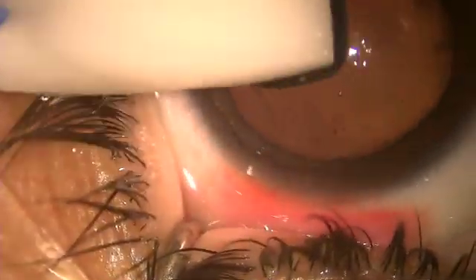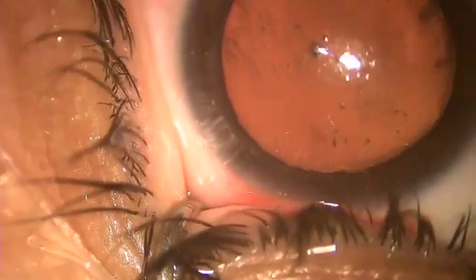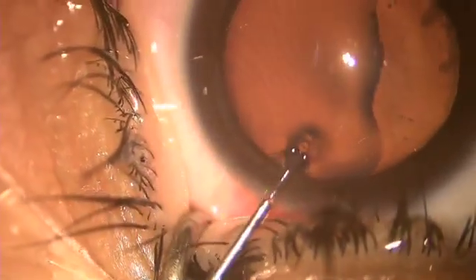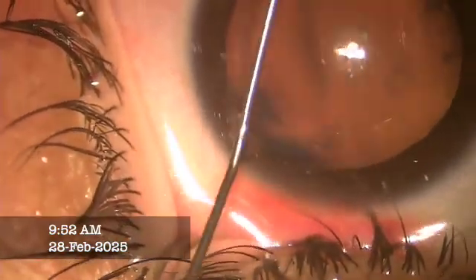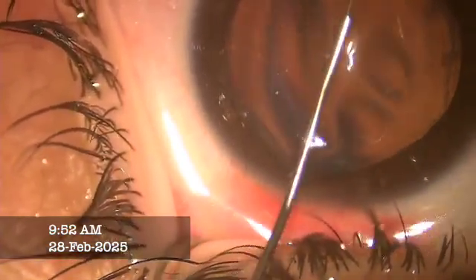Now here you're seeing with the wet sponge, what I'm doing is trying to remove these folds which are there. Gently. That's the trick. It's going to take a long time. What happens is with the warm BSS, the collagen fibers become a little pliable and these folds which are seen can be removed. We are again going in, again going into the flap, again use a little warm BSS to try to iron out those folds which we are seeing. This is done 2-3 times.